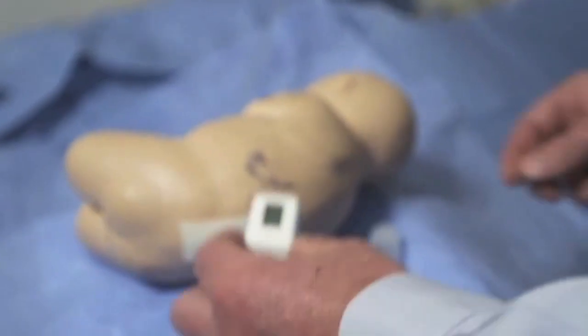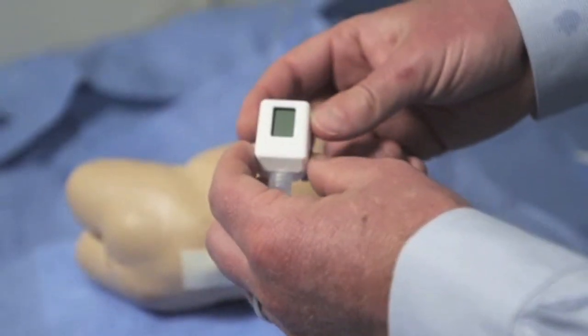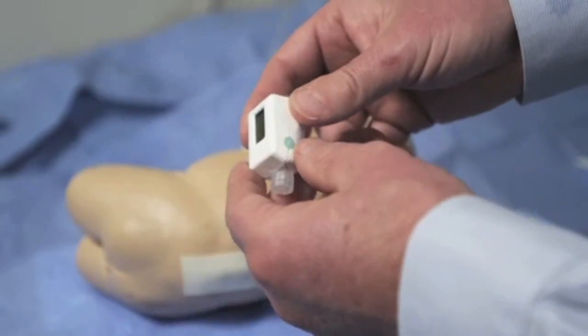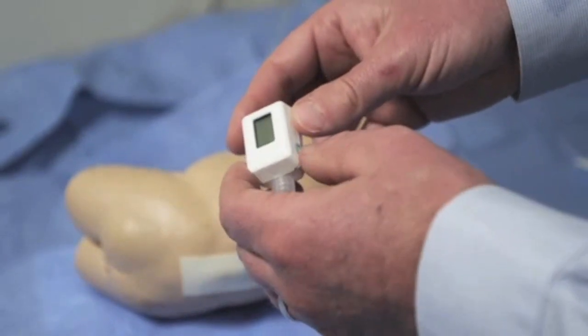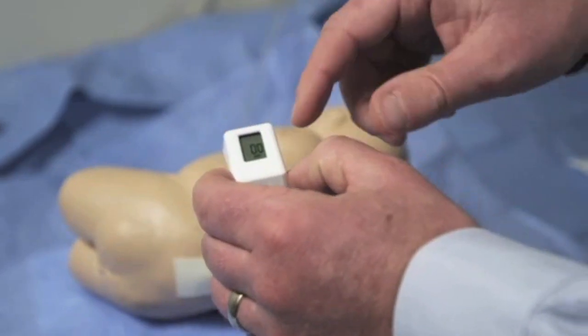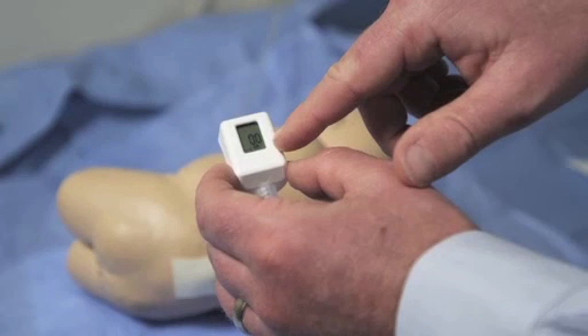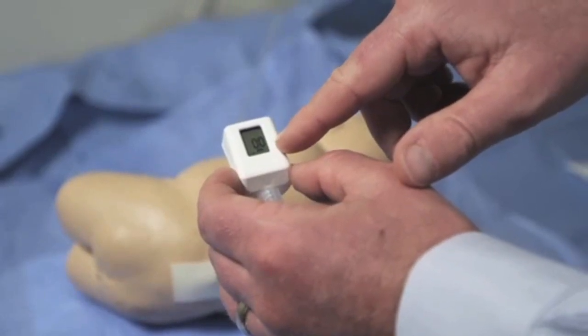Once the device is removed from its sterile pouch, it can be turned on and calibrated by depressing the green button on the side of the device. It's important that the button is depressed long enough until 00 is displayed on the screen, at which point the device is turned on, calibrated, and ready for use.